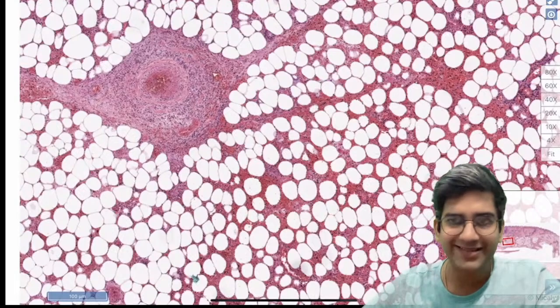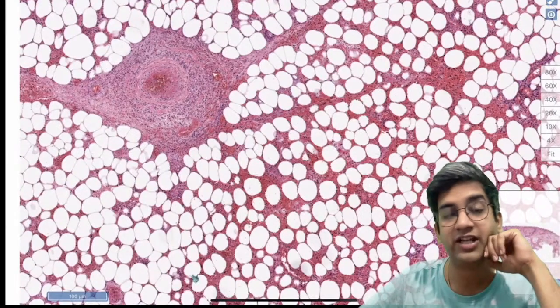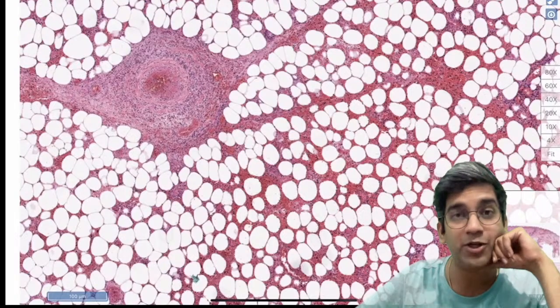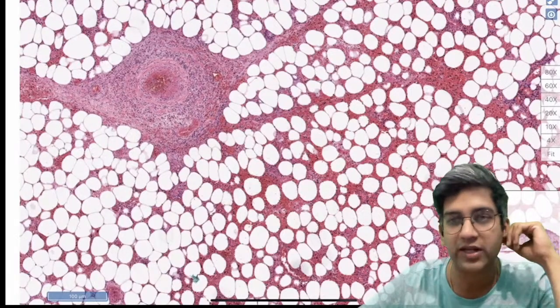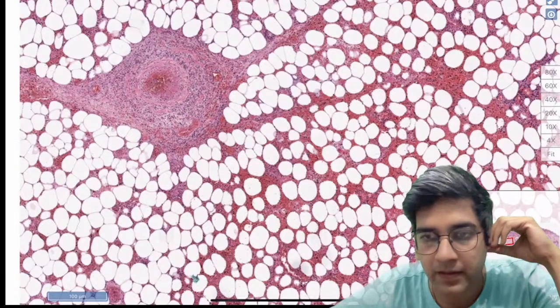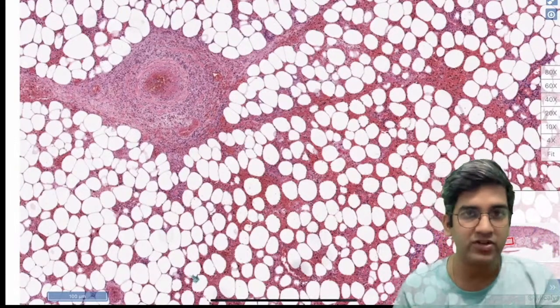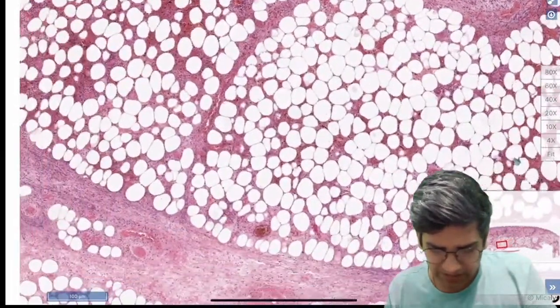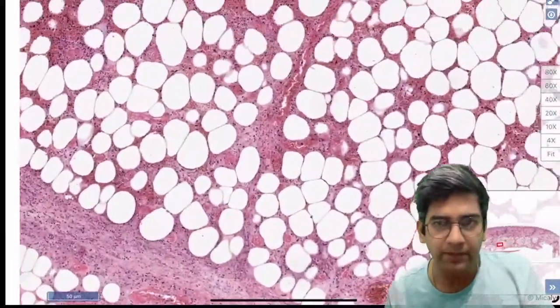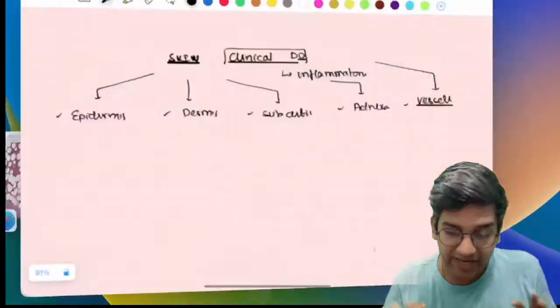Pranit, I'll always take lymphocytic infiltrate with a pinch of salt. Lymphocytic infiltrate is definitely pretty common in quite a few conditions, and it does not actually give me any pointers to a diagnosis, fine? Septa and subcutis abnormal as per Hakim, right? Do you guys accept that whatever Hakim said is right? The septa and subcutis kind of abnormal? Yes. Okay.